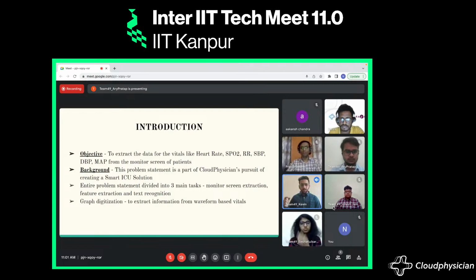This is part of Cloudphysician's pursuit of creating smart ICU solutions. The problem is built on a pipeline divided into 3 major stages. The first stage is monitor screen extraction, the second is feature extraction, and the third is text recognition. Adding to this, we have the graph digitization part of the heart rate, to extract information from the waveform based vitals.